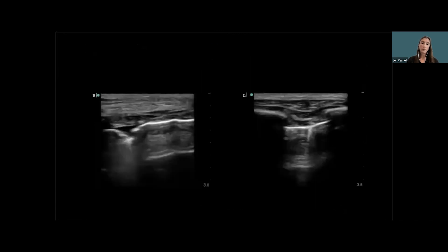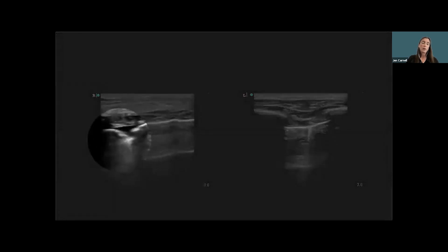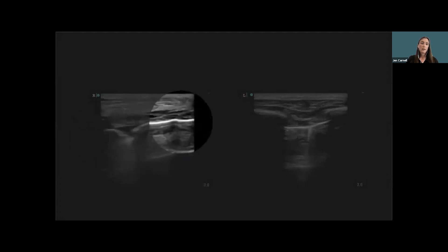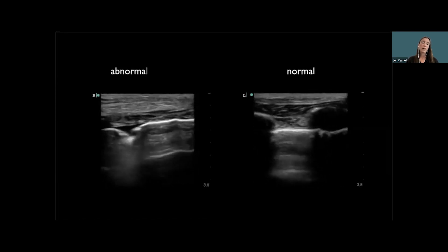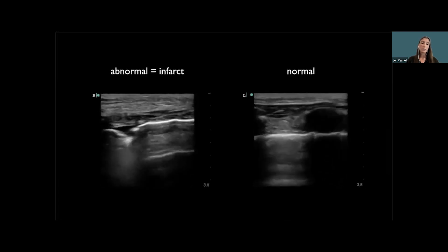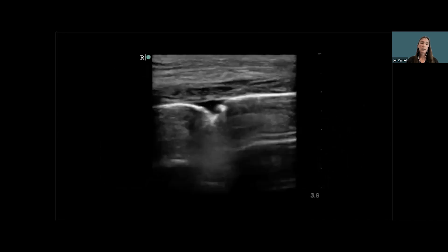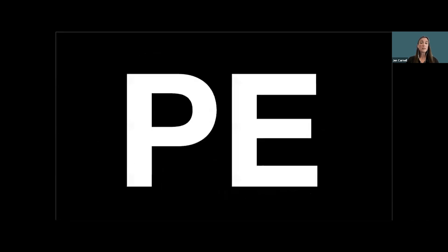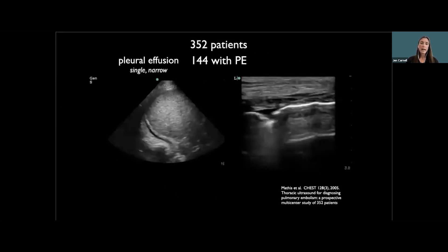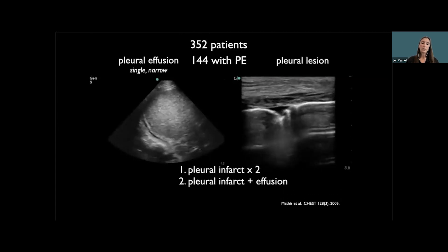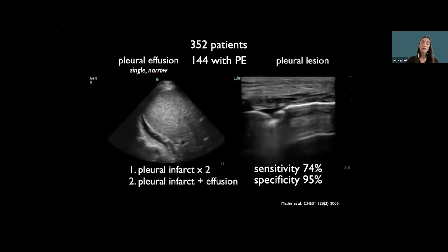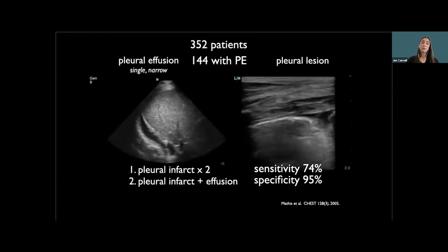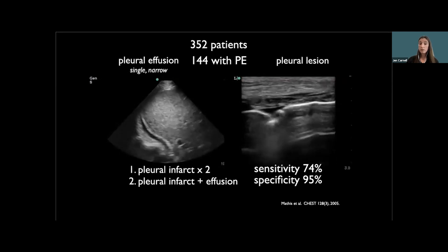I switch to my high-frequency linear probe and can see the pleural line really well. There's a triangular divot cut out from it. On the unaffected left side, the pleural line is nice and smooth with no divots. This wedge-shaped black irregular area is probably a peripheral pulmonary infarct. In a study where nearly half the patients had PE, finding either pleural lesions or infarcts, or a pleural infarct with a small unilateral effusion, gave a specificity for PE of 95%. These findings bump PE way up on my differential when the clinical situation fits.